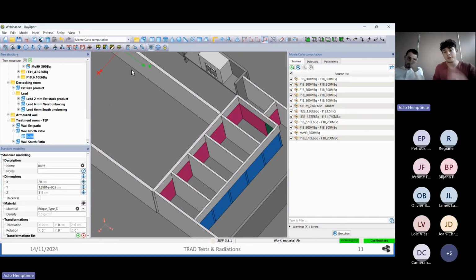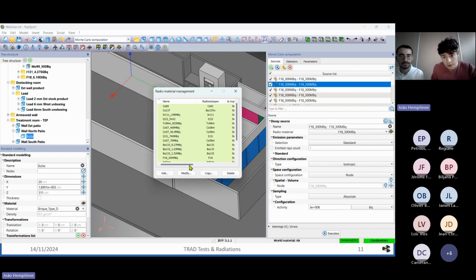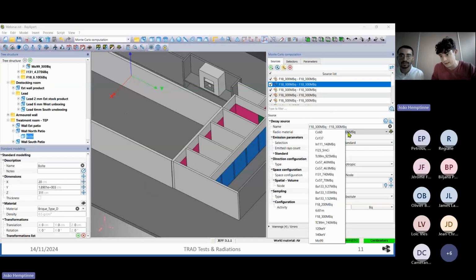Yes, so when the geometry of the model is over, you have to set the different sources. Here you firstly go on the Monte Carlo computation mode, and here you got 3 different menus. The first menu that we are going to present is the source menu. Here you got the different sources present in this model. So for example, let's take the 18 fluor. If you want to set 18 fluor sources, you just have to create your radio material. Here you can pick the right radioisotope and select the right atomic number. After that, when the radioisotope is present in this list, you can select it in this list.